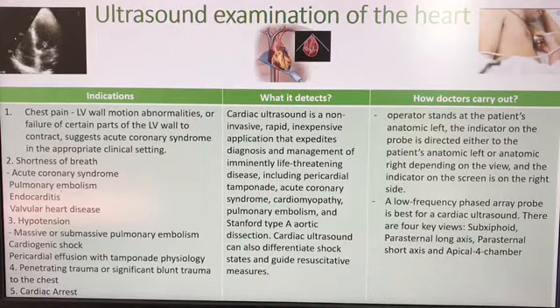What does it detect? It is used in diagnosis and management of imminently life-threatening diseases, which include pericardial tamponade, acute coronary syndrome, cardiomyopathy, pulmonary embolism, and Stanford type A aortic dissection. Cardiac ultrasound can also help to differentiate shock states and guide resuscitative measures.